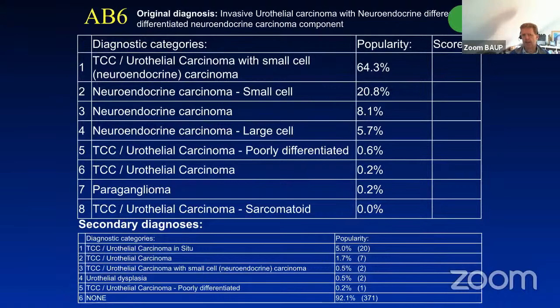No, I think most people would recommend you giving a percentage for each of the components in a tumor, even if it's a 5% small cell. They're unlikely to do anything different with a 5%, but when it comes to 50% or higher, then they may do something.